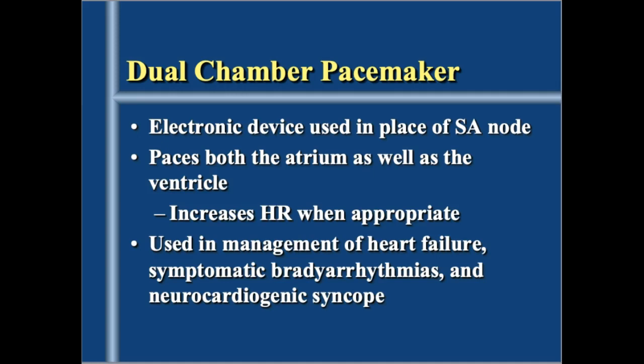But these are miracle devices, and we don't think of them that way now because they've been around so long. Just as recently as I think the 60s is when pacemakers were invented, and people who used to die now live for years and years with very high quality of life. So you can have a pacemaker that just paces the atrium, one that just paces the ventricles, or one that paces both.